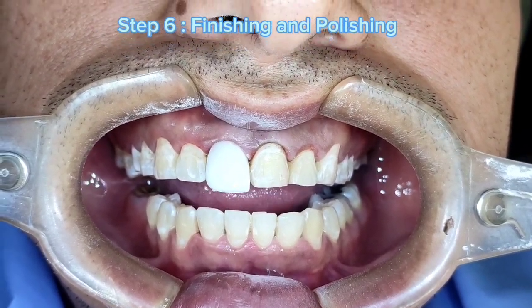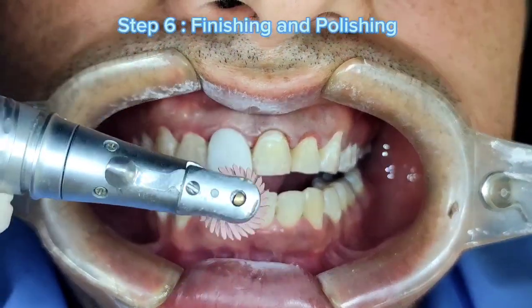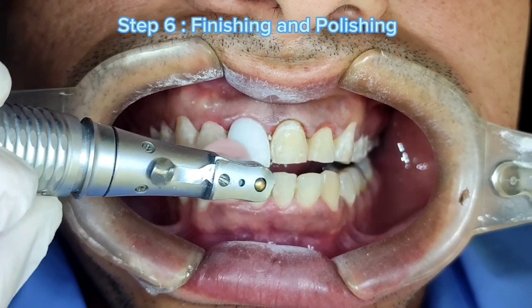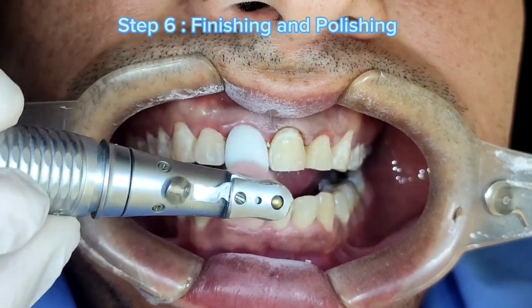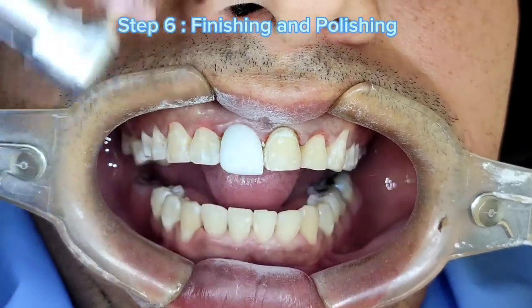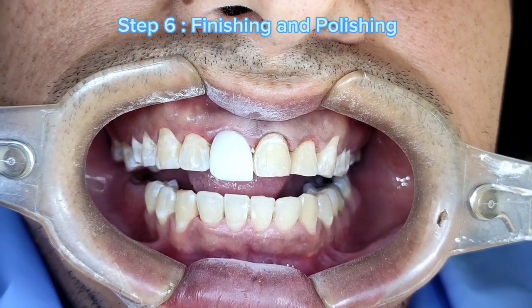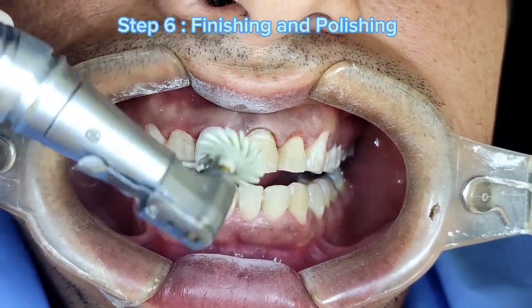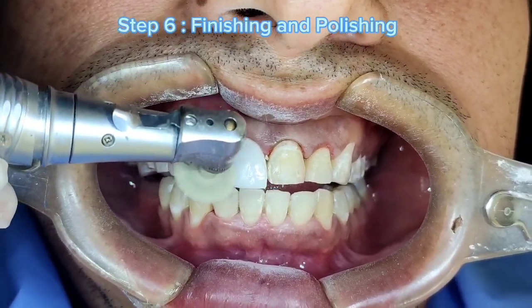After the black disc, I use the 2 wheels of the F-Diacom system. I start with the pink. The pink works as an eraser, to erase the junction lines and the mistakes that I make with my hands and with the spatula. This is the eraser, the pink. And I finish with the white. The white is just to make shine, and remember, more time, more shine.